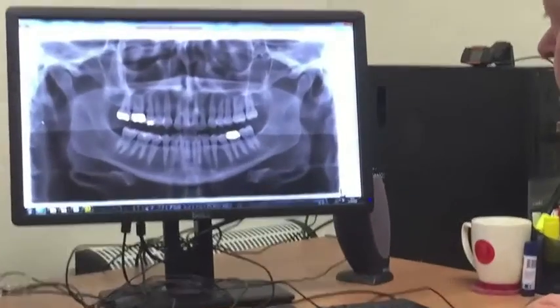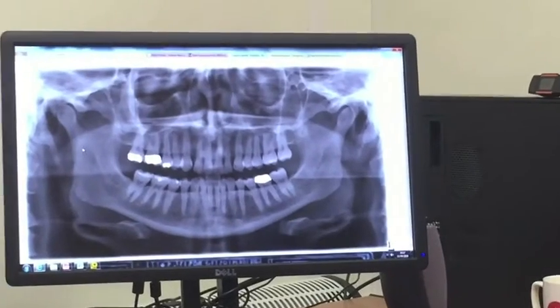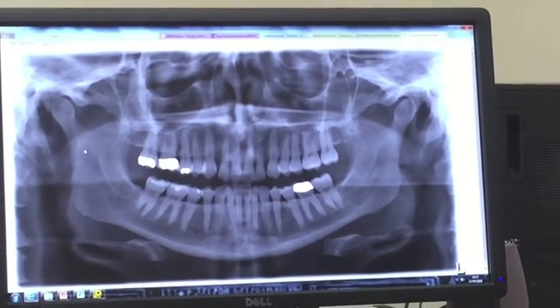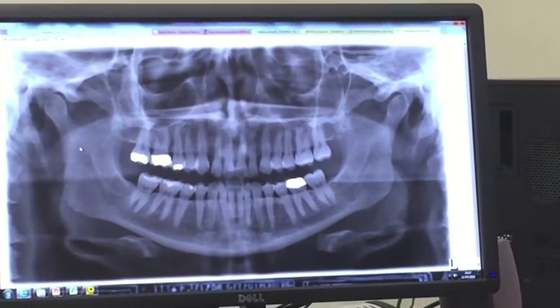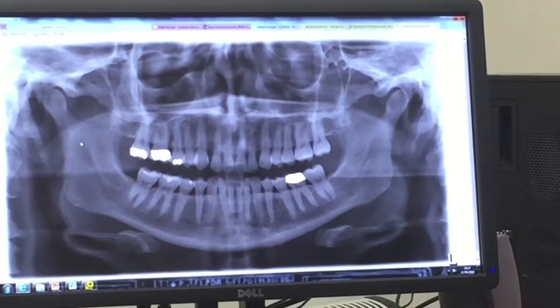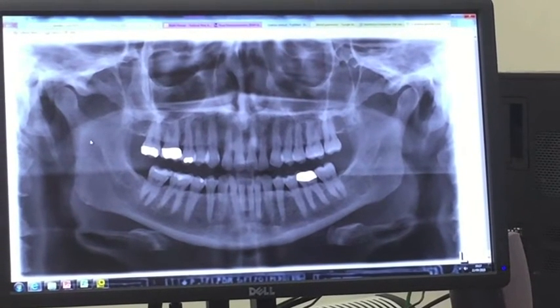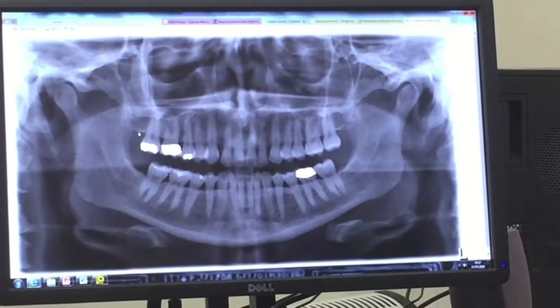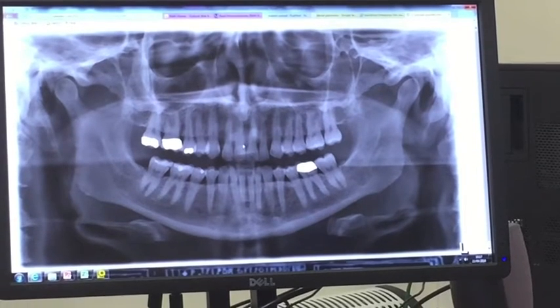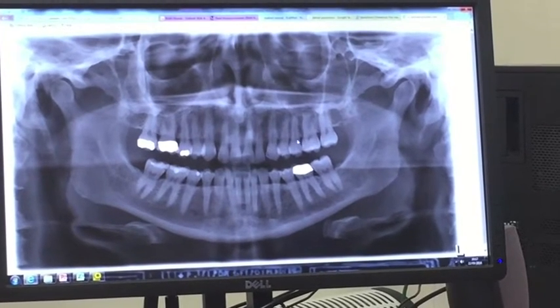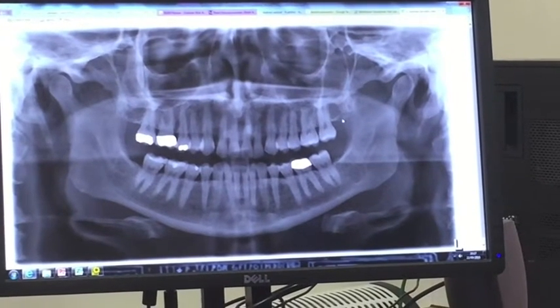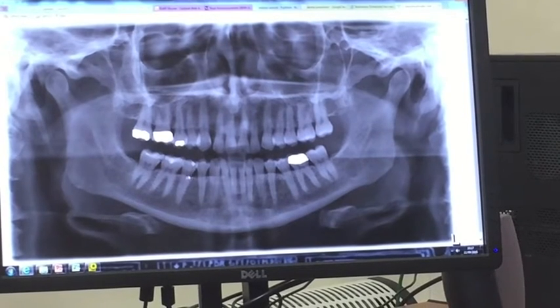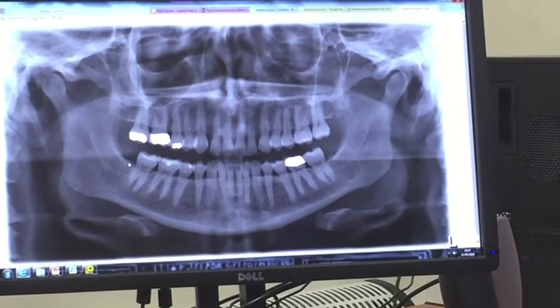I'll be pointing with the cursor here to help you along. When I see a panoramic radiograph for the first time to do the reporting, I would always first of all start with the periodontal bone panels, which you should be able to identify fairly easily as you go around. I will always tend to go around in a clockwise direction.